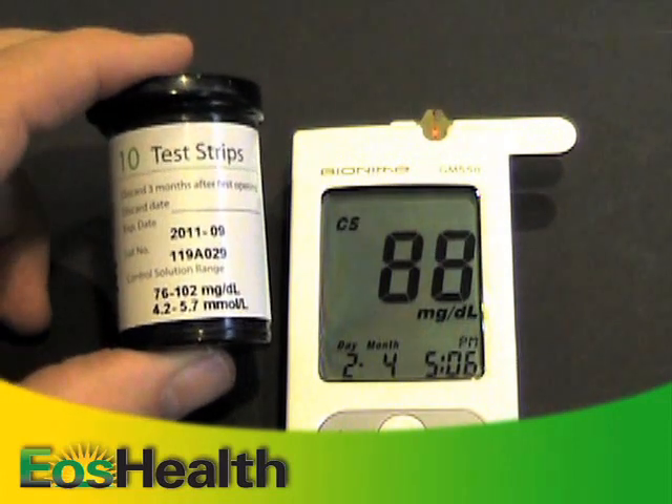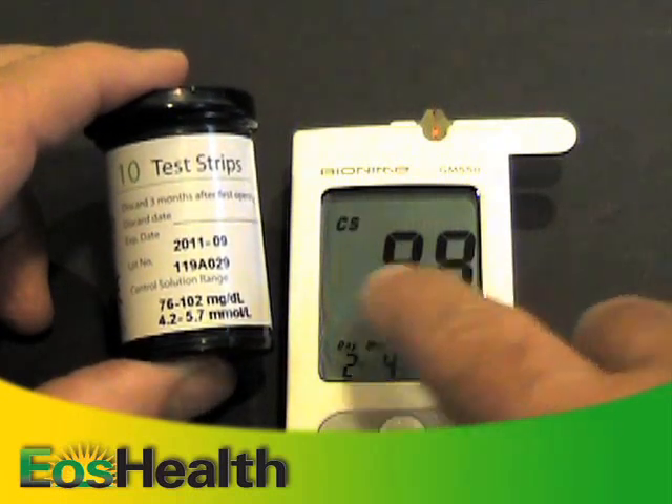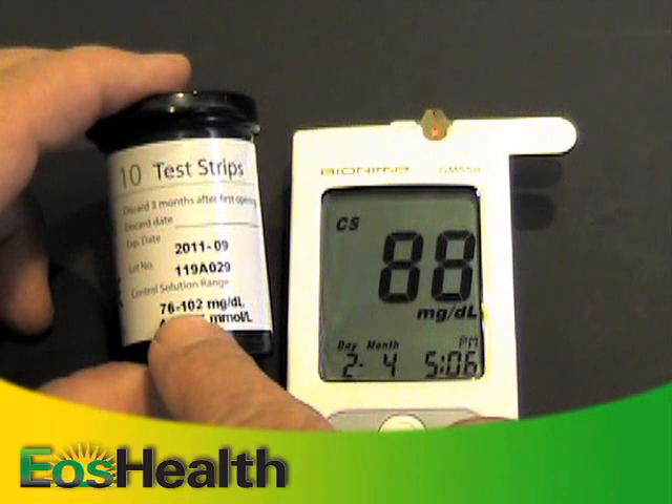Compare the test results on the screen to the range printed on the bottle of test strips. There — now you've completed a QC test for the meter.